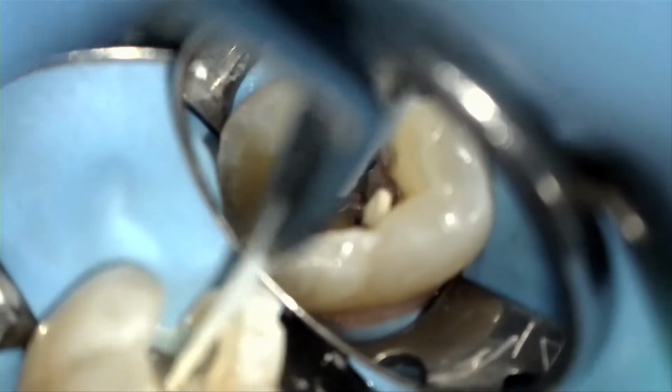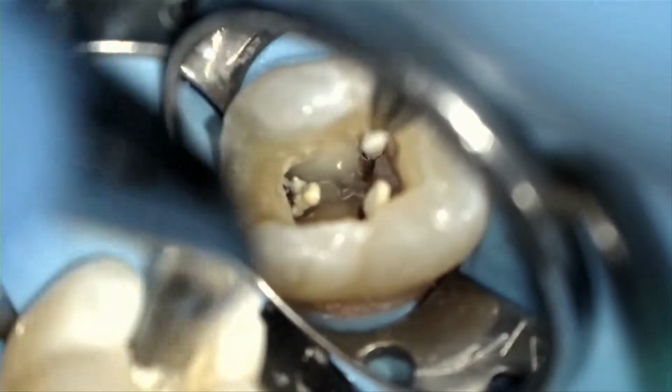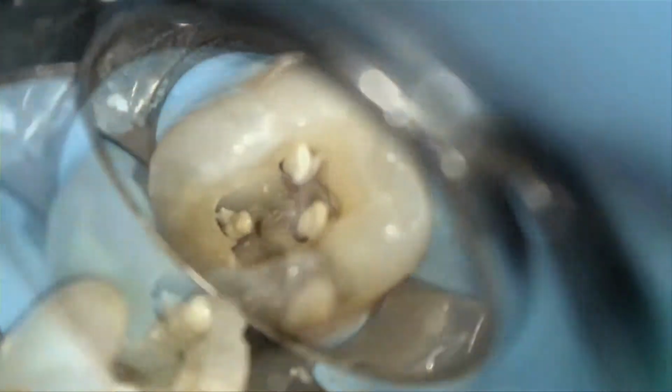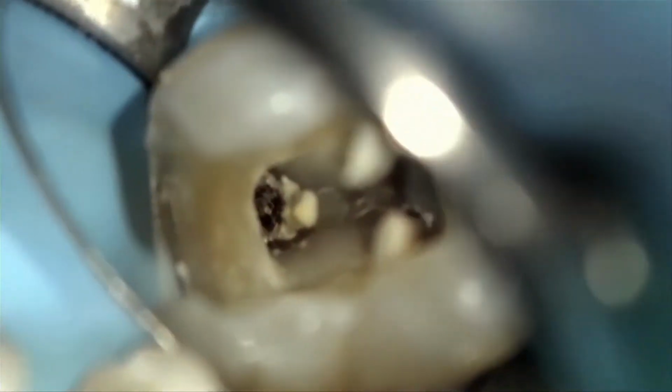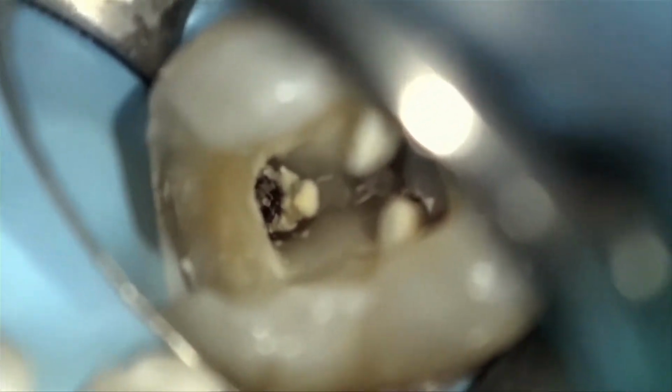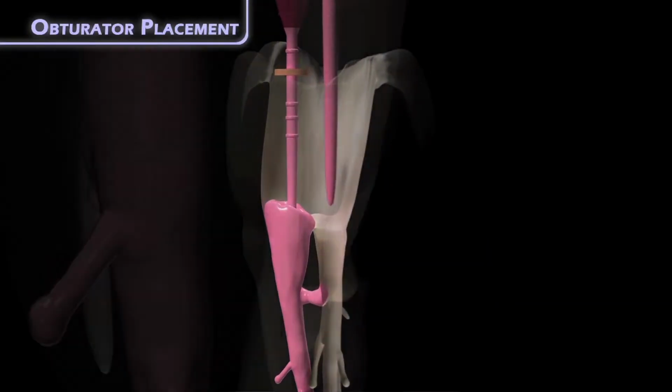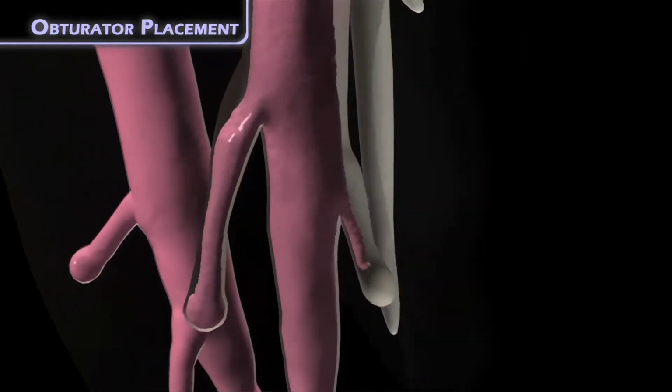To improve visibility into the pulp chamber, I personally recommend cutting a paper point at or below the occlusal table. This will improve your visibility into the pulp chamber and prevent interfering with the warm GuttaCore as it's inserted into an adjacent canal. Once the canal is obturated, simply remove the adjacent paper point and you're left with a clean and clear path to obturate the next canal.